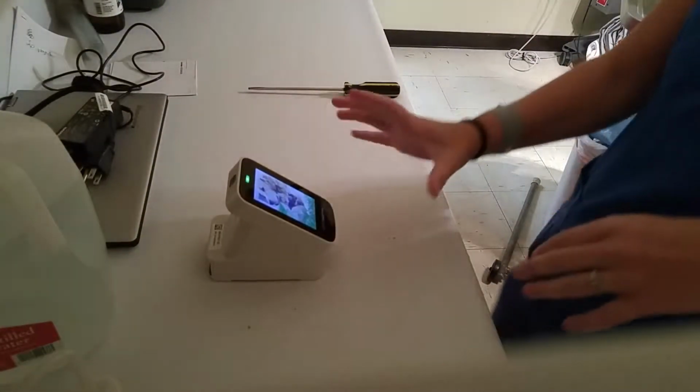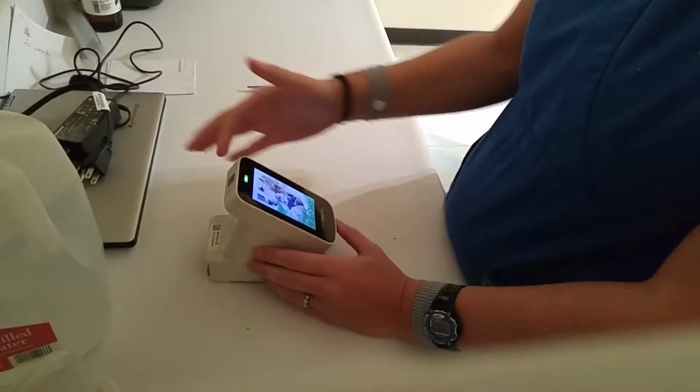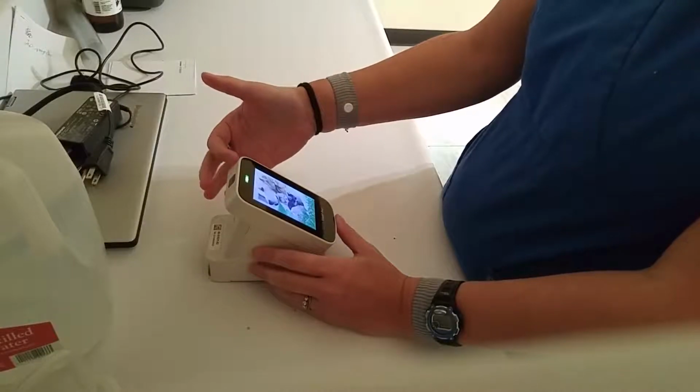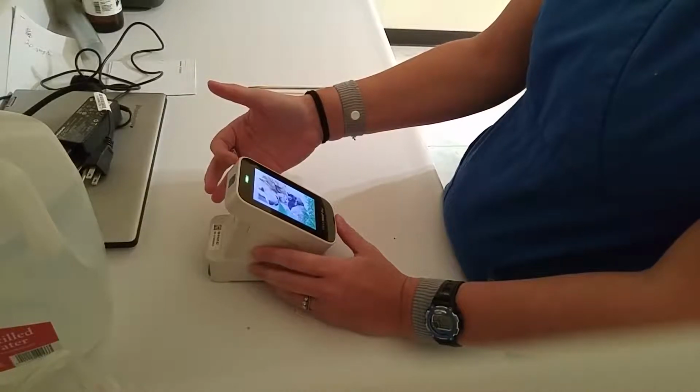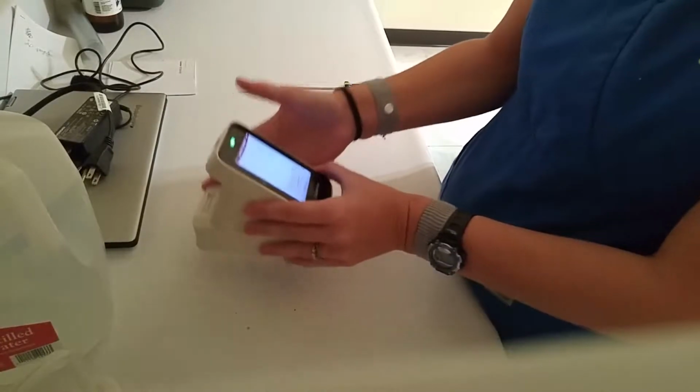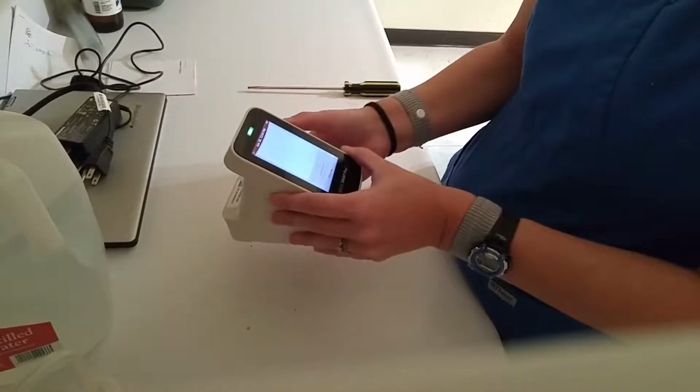So we'll let this turn back on. Make sure that the internet signal is good. And then we'll also make sure that the battery status is good. Since it's been plugged in, it should be fully charged, which it is. So we've got that there.